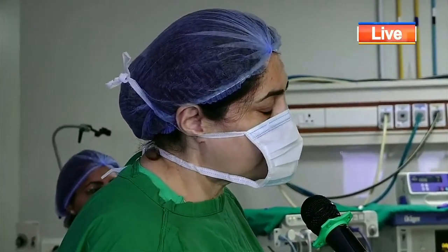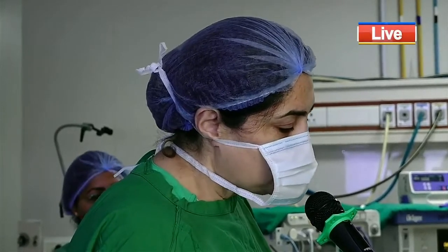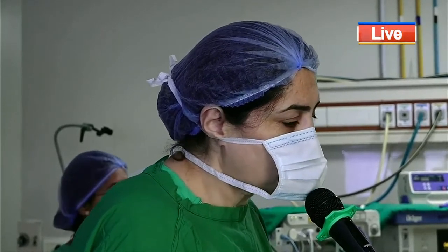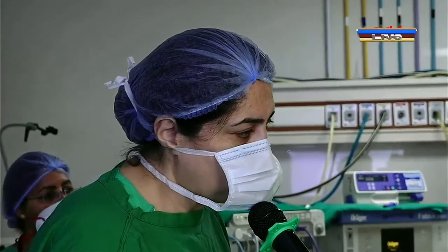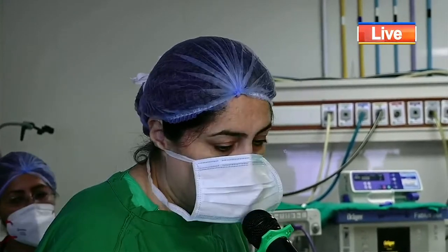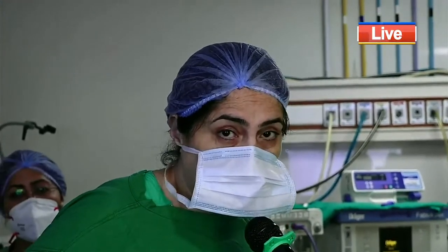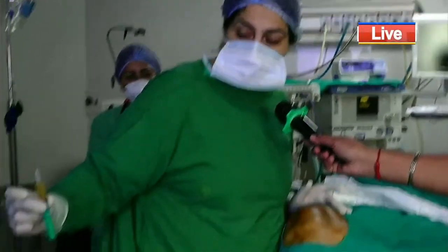So we are going to give PRP for her and we are going to give a genicular nerve block. For the PRP injection, we have taken the patient's own blood, made the PRP, and sent it to the blood bank over here. Can you zoom in here? I have taken the PRP, it's in a 5 ml syringe, you can see it over here, right?